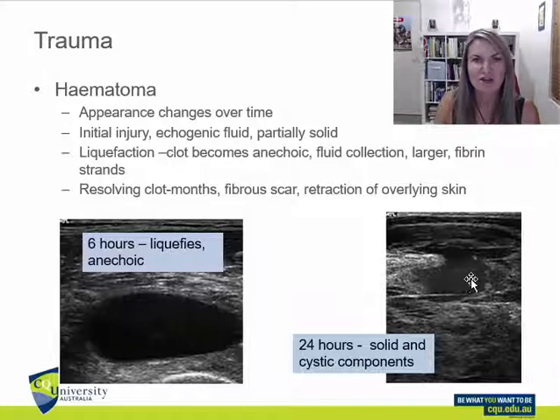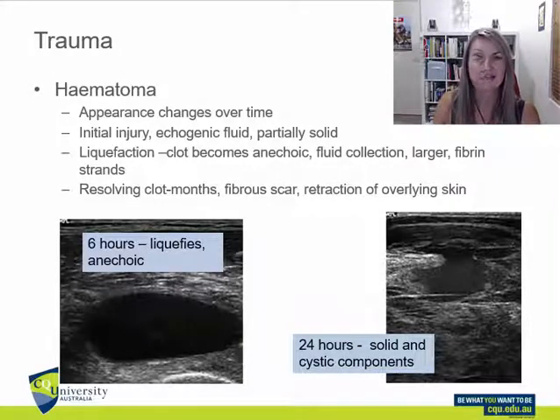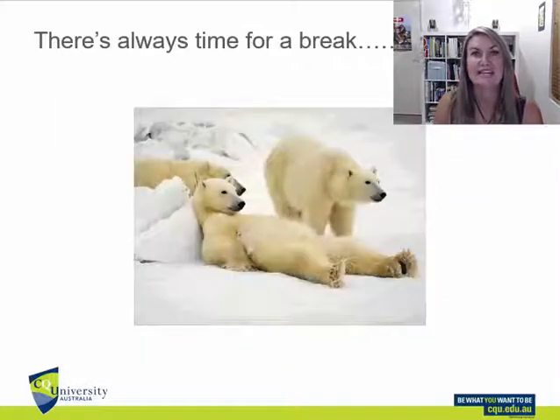So you'll see those low level echoes as the clot's starting to resolve, and you may see little bits of the fibrous strands flicking in and out there as it starts to look a lot more solid. So it will change over time. It's not all going to be exactly the same, but be mindful that in those first few hours, particularly in the first day, it's going to be quite painful. So gently does it is really the guide for you.